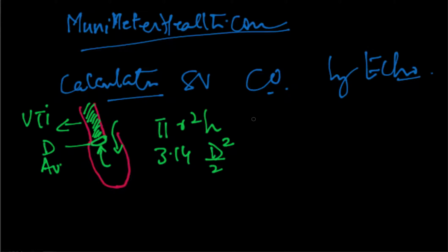Okay. So remember, when you're calculating the stroke volume, you're doing it on the chest, obviously. The heart is, say, sitting, let's use a different color quickly. Heart is sitting here, and this becomes your apical view. We're not going to use the apical view. We're going to use the long axis view. And the long axis view will give you this measurement, and the view will look more like this, if you will.